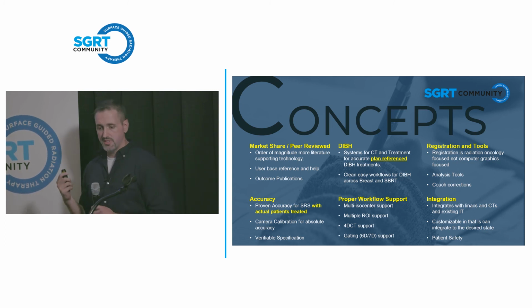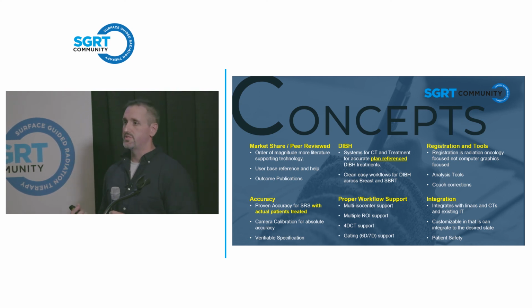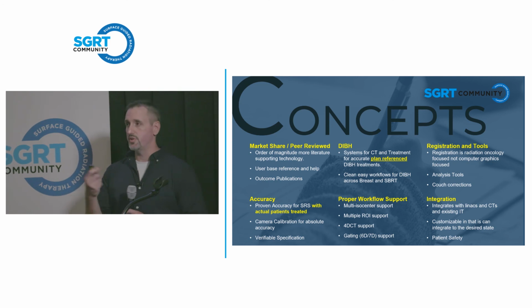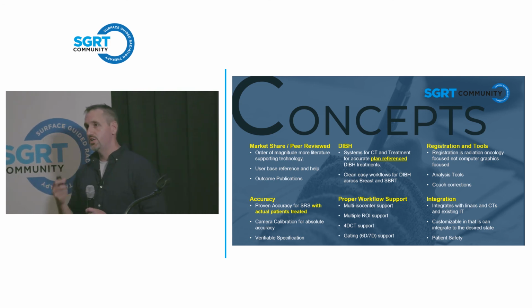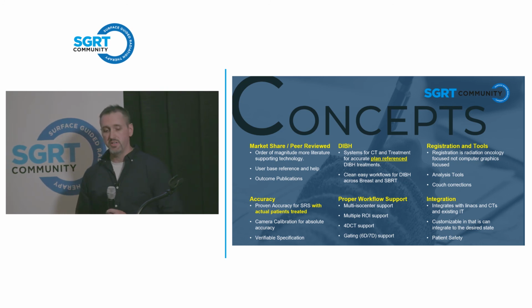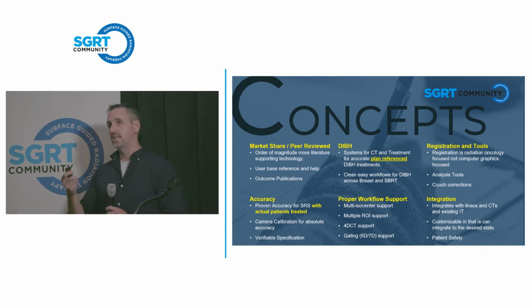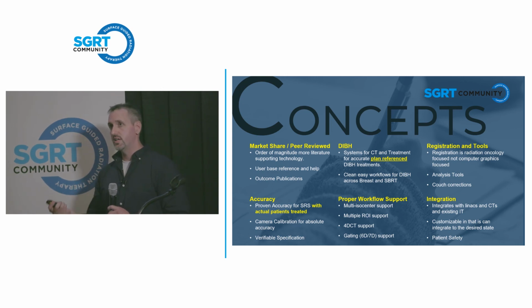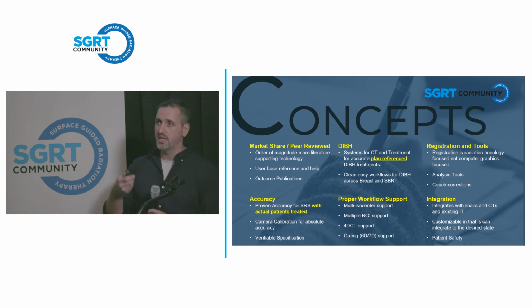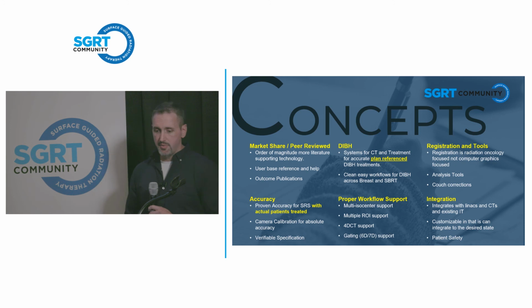The only thing I really want to talk about with DIBH, if you're using these systems for DIBH, you really need to remember that we use plan reference as gold standards in radiation oncology. If you're taking ports, you're using DRRs. If you're doing cone beam CTs, you're using reference CTs. You really need to have a plan reference DIBH approach, and that is not the case with all vendors. And so you really need to look at what is your DIBH workflow, what do you plan on doing, and if you're going to implement it, is it done in the way that you're used to it happening in radiation oncology. If it's not plan reference, you need to come up with a way to kind of work around that idea and link that back to the plan.